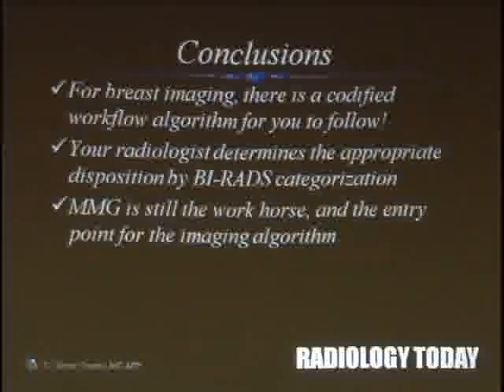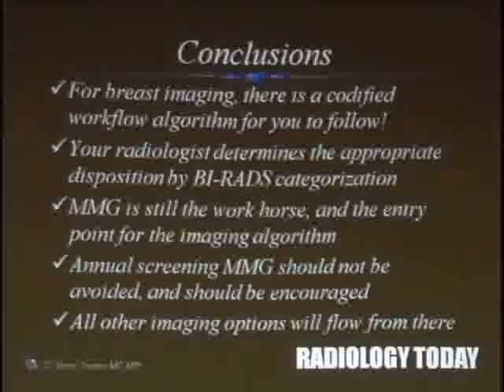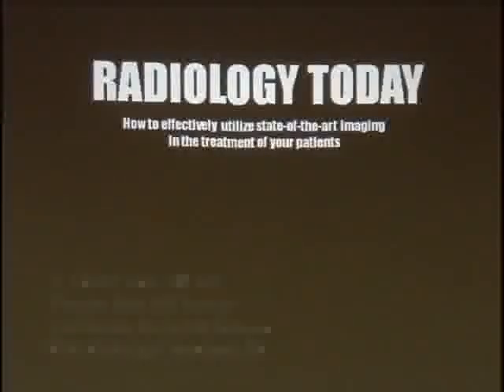Mammogram is still the workhorse and the entry point to the entire algorithm. Annual screening mammography should not be avoided. It should be encouraged, always with vigor. Don't let your patients talk you out of it, no matter what they bring you from the internet. All other imaging options flow from that point. That's it.